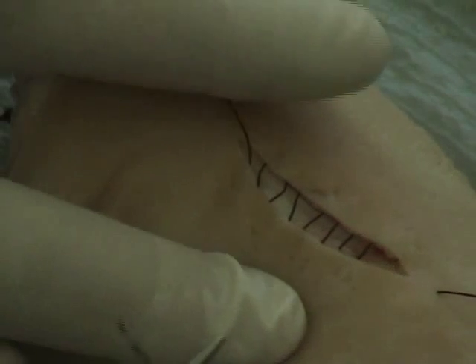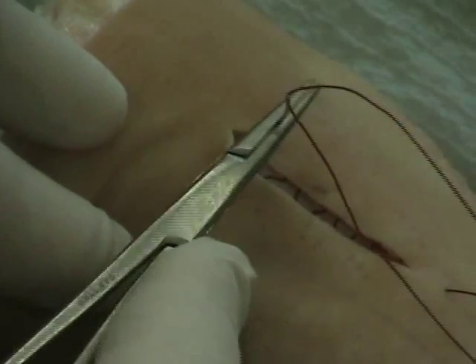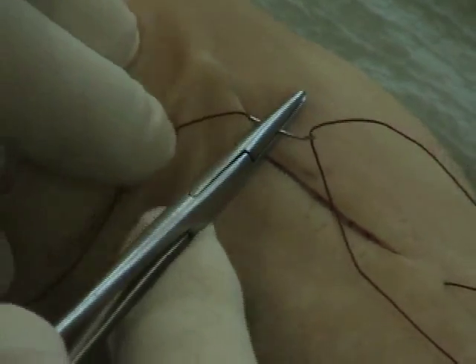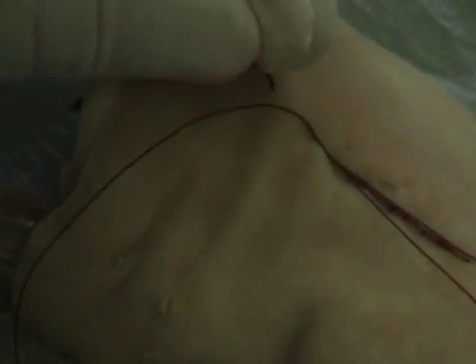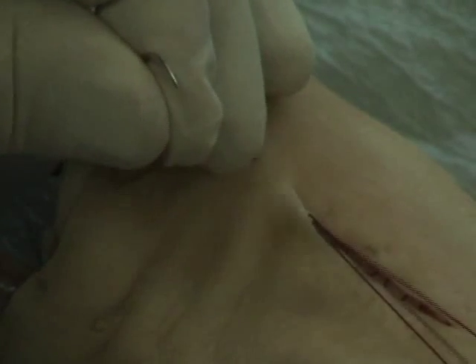Make sure your lines are pretty parallel to each other. When I get close to the end, I just go under the skin and pop up about a quarter of an inch back from the end through the skin. Then I take the stitch, pull it together, and that's what it looks like when it's closed up.